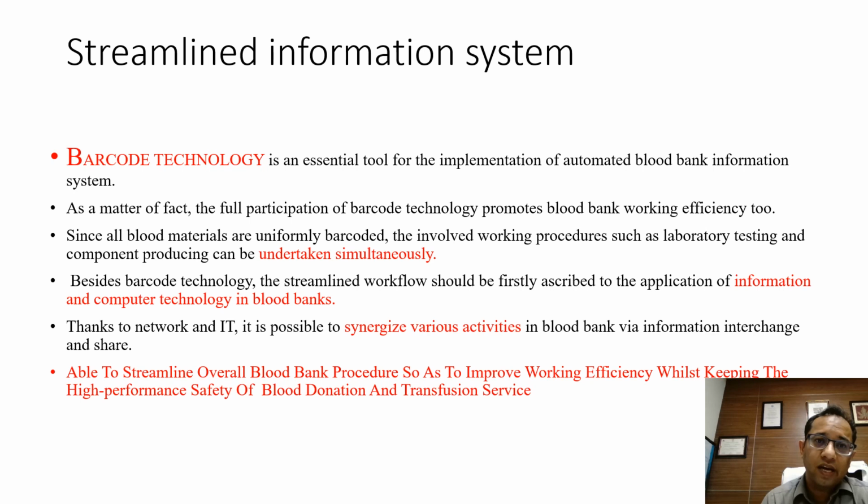The third aspect of the design is a streamlined information system. In this, a very, very vital role is played by barcode technology. Now, this causes full participation of barcode technology, promotes blood bank efficiency, and so many of these things that you are doing, like blood component separation, infectious marker testing, donor recruitment, donor selection, all this can be undertaken simultaneously if you have a barcode. So various samples can go to various labs, and all of them will have the same barcode. So you are doing the work simultaneously.